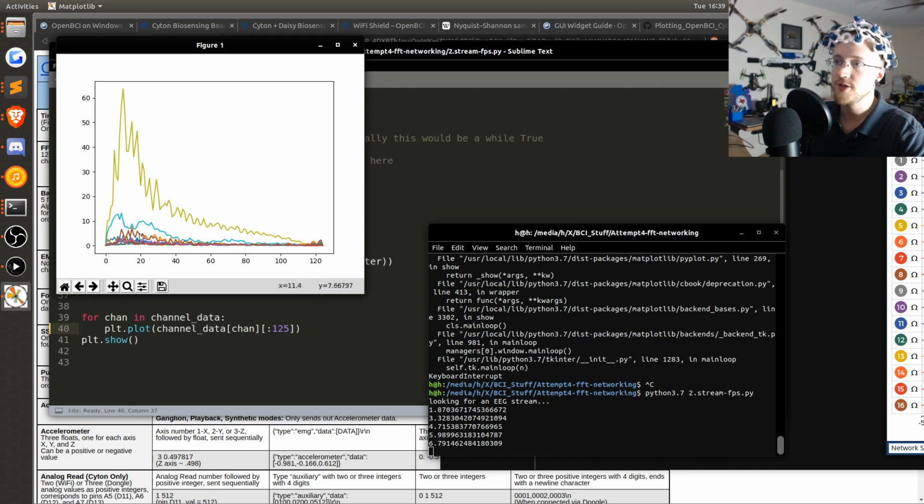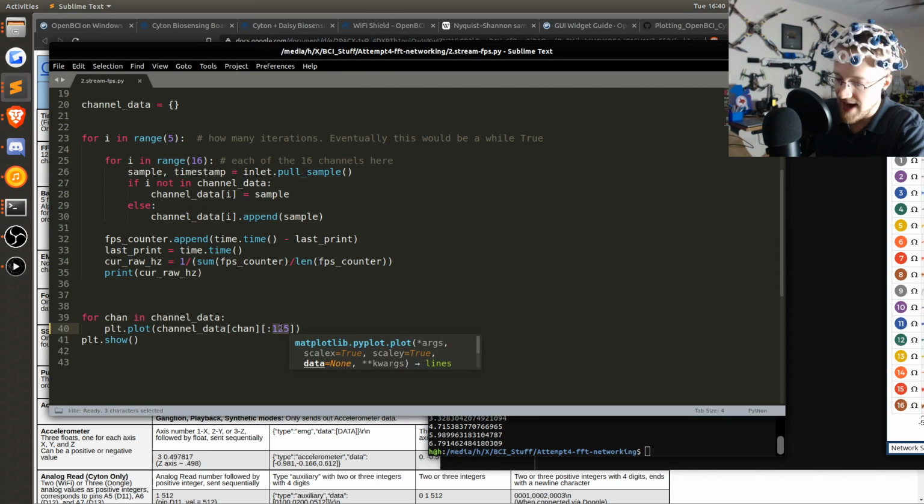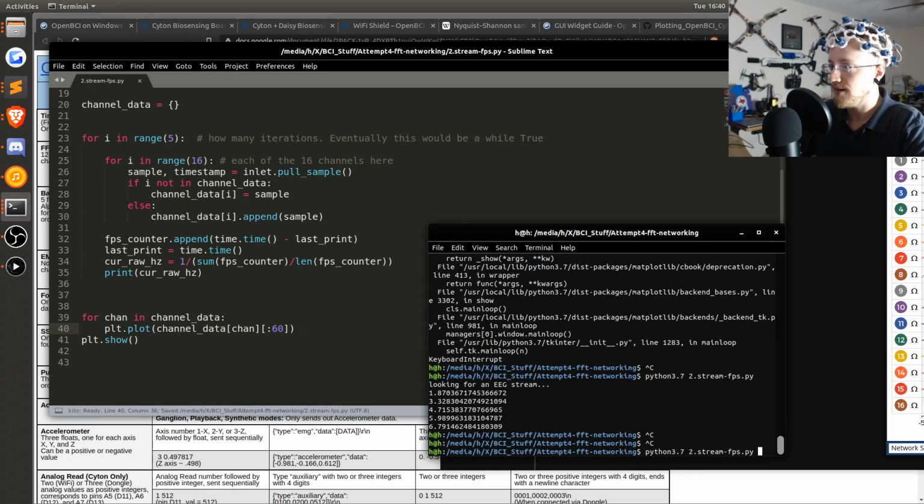Anyway, so as you can see, it does actually go beyond that. But again, Nyquist theory. Anything beyond 60, I suppose, is probably useless. It's not reliable information, so we toss it. So anyway, the information we actually want is at this point here.